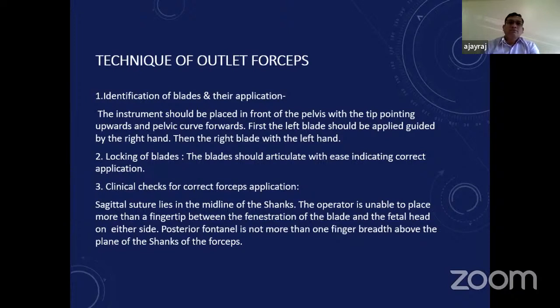Locking of the blades. The blades should articulate with ease, indicating correct application. If the forceps is not applied properly, then the locking will not happen. And if you apply pressure to force it, then the baby will pay for it.